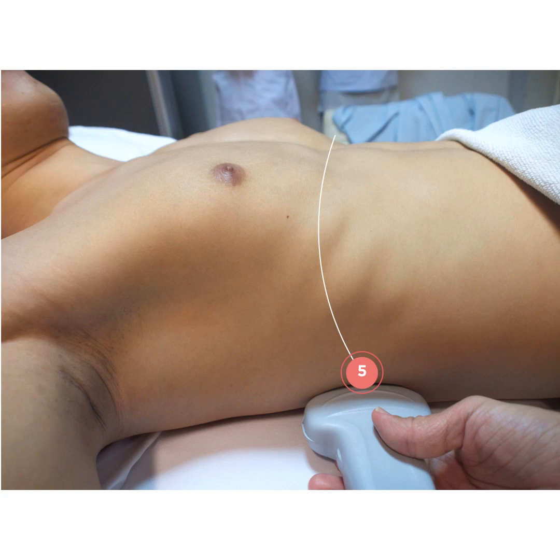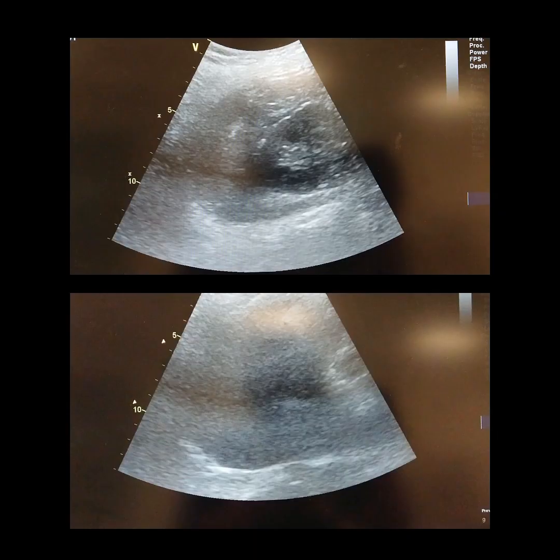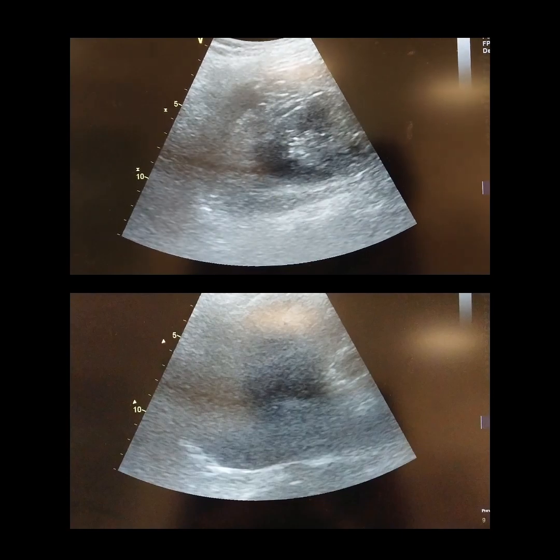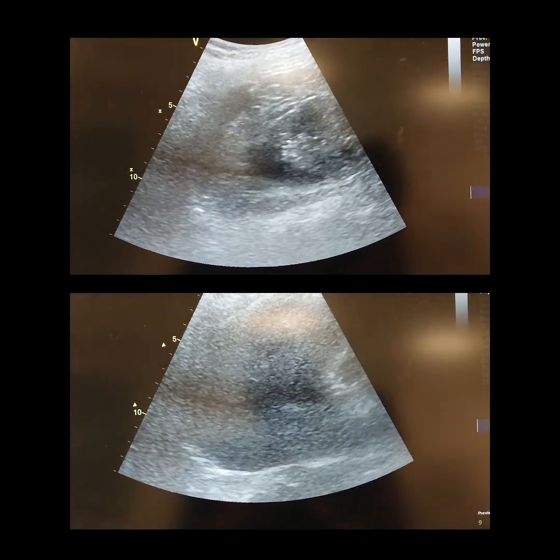On this video, I would like to show people who can perform EFAS how to see diaphragm movement from the EFAS field. You put the probe horizontally on the right upper quadrant and left upper quadrant, in the area between the thorax and abdomen. The first clip shows the normal side — you can see the right diaphragm moving.